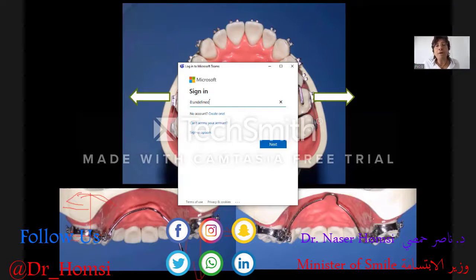Yeah. To be honest, if I want to expand only the molars and then expand the rest of the arch by means of the archwire, like Daniela, I prefer to expand only by means of the transpalatal arch, to have something more rigid than a quad helix, which is longer and so has a lower load deflection ratio.